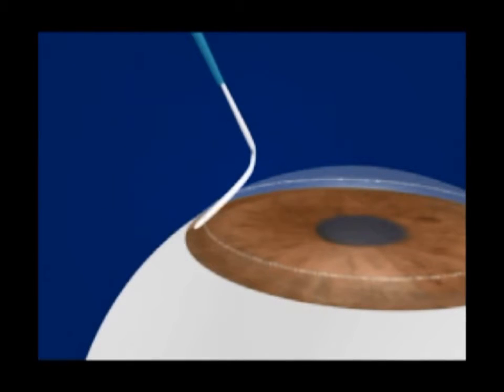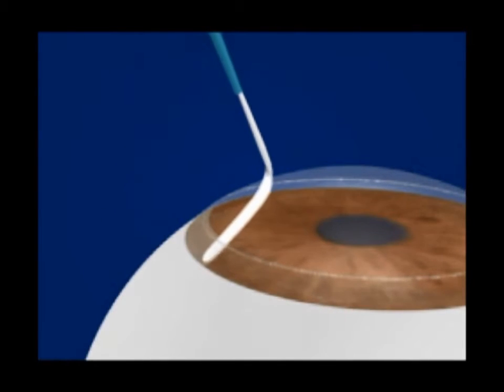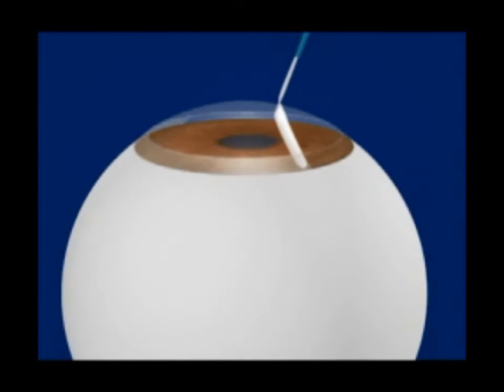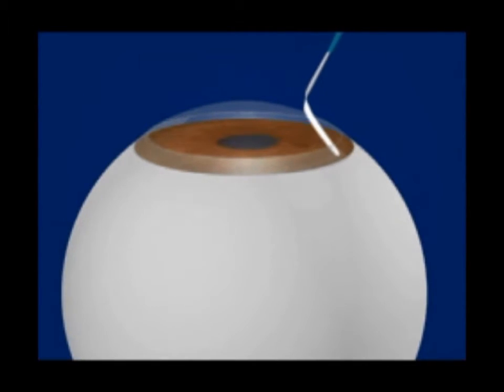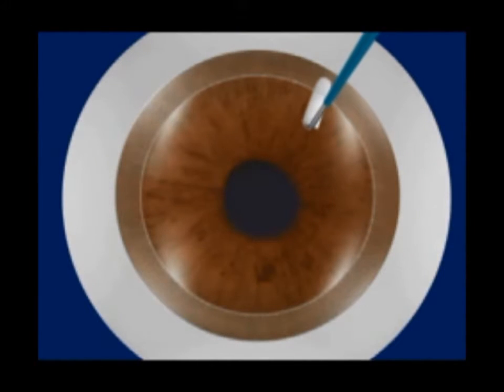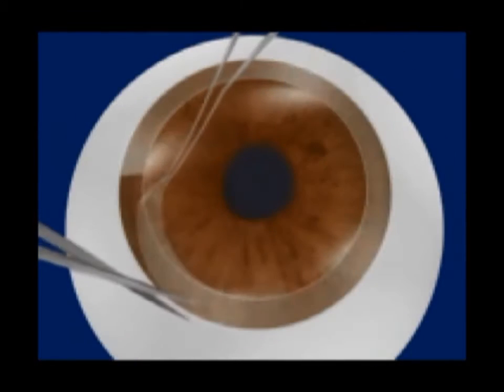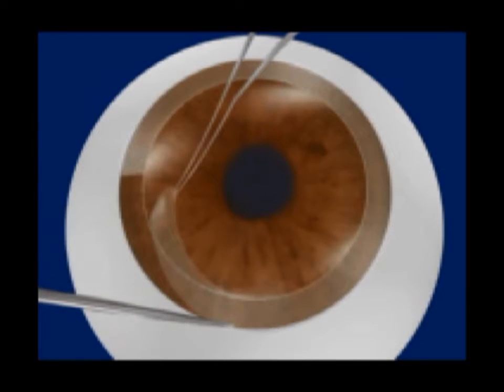The dissection proceeds two millimeters into the periphery. With this dissection, a superficial strip of cornea is created which is 300 microns thick and two millimeters wide. This strip of corneal tissue is then excised.